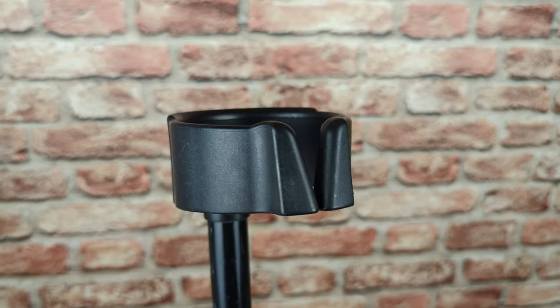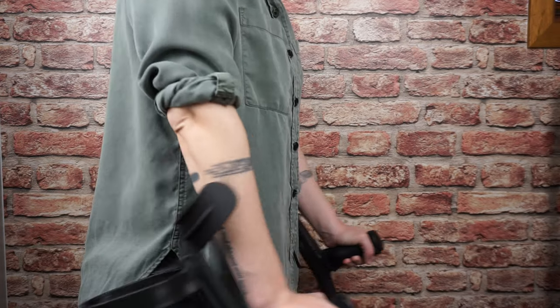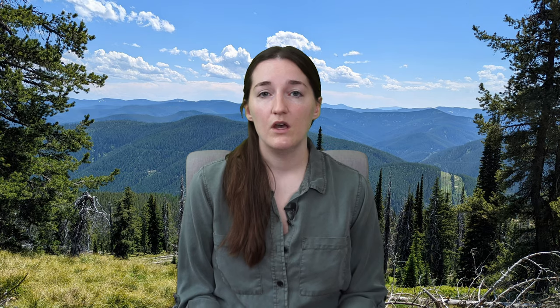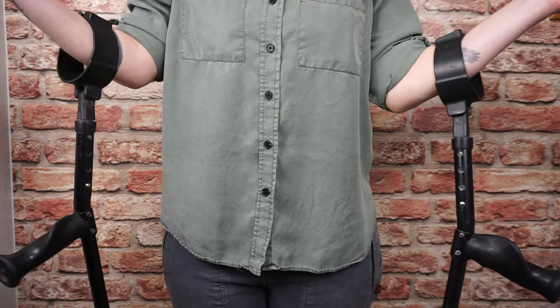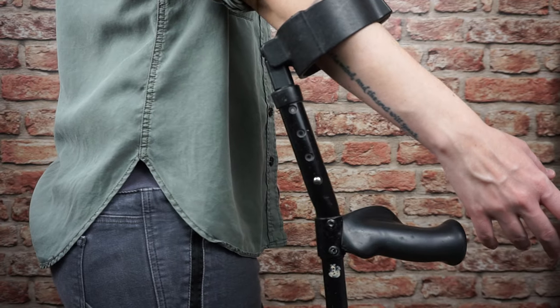If you are brand new to forearm crutches, I will briefly go over the different parts and features that crutches can have, but if you already know all of this, feel free to skip to the next chapter. Starting with cuffs — this is the part that goes around your forearm and it can either be an open or a closed cuff, where the closed cuff has that extra piece that goes all the way around the forearm. Open versus closed cuff style is really just a matter of preference. Open cuffs are great for people who want the freedom to quickly take your arms out of the crutches, whereas the closed cuff helps the crutch stay in place so you can move your arms around freely without having to worry about the crutches falling — for example, if you're opening a door or shaking someone's hand.